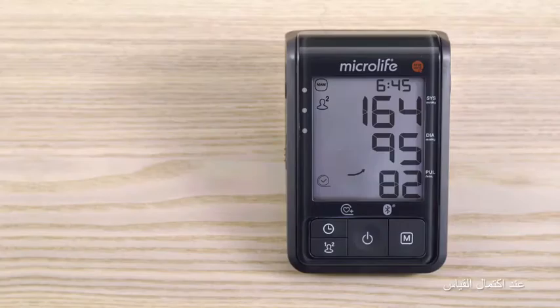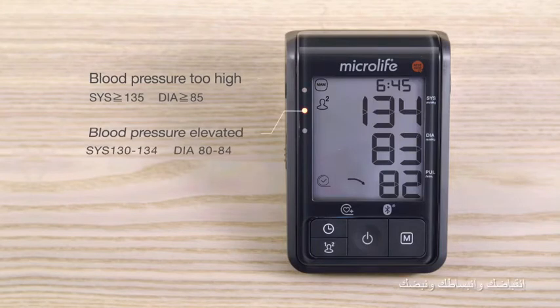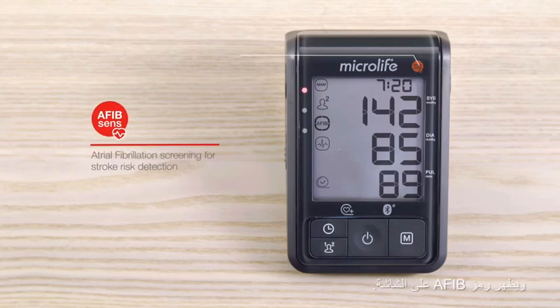When the measurement is completed, the B6 shows on its large display your systole, diastole and pulse. The LED light informs you how the results are classified by doctors. If atrial fibrillation has been detected during the measurement, the AFib SENS indicator starts flashing and the AFib symbol appears on the display.